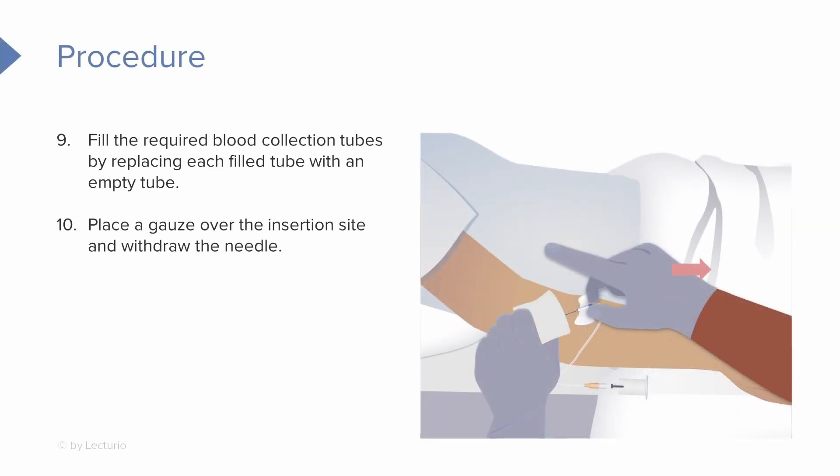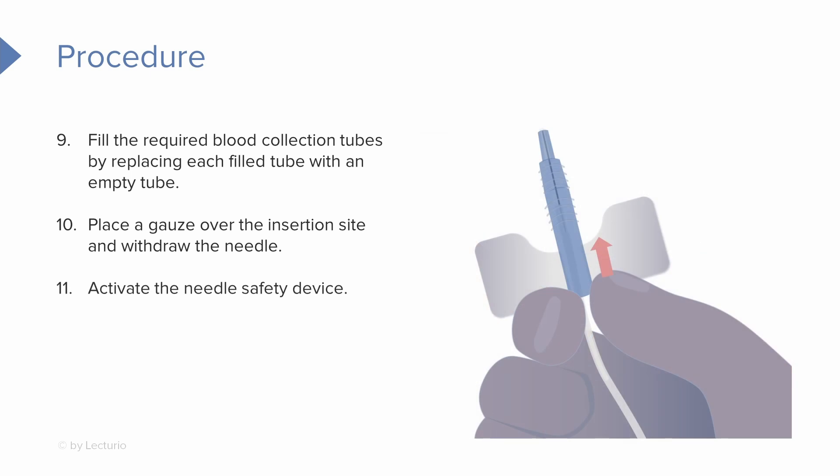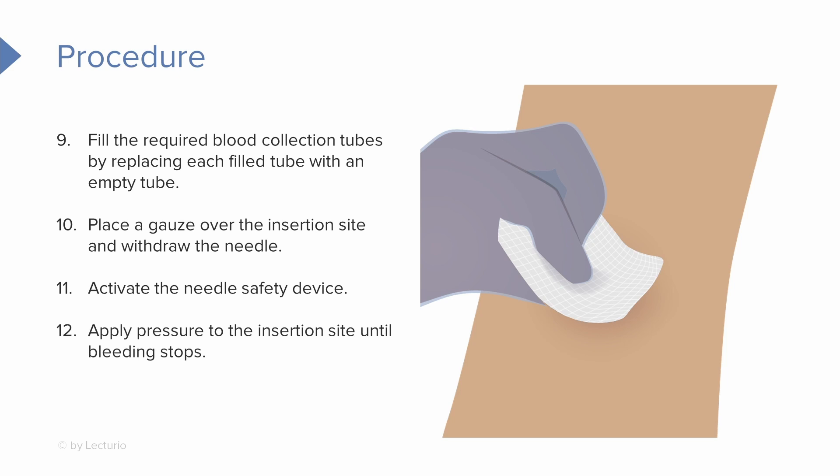Once we've collected all of our labs, we can place our gauze over the insertion site and withdraw the needle. And of course, activate the needle safety device. It's a good idea to hold pressure to the insertion site using that gauze until the bleeding stops.